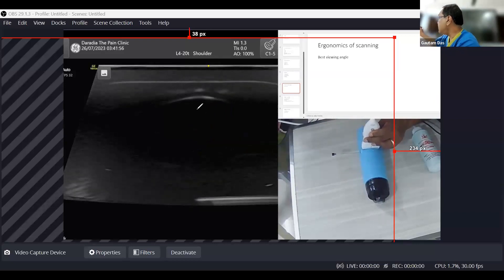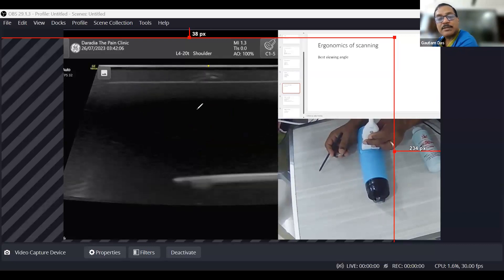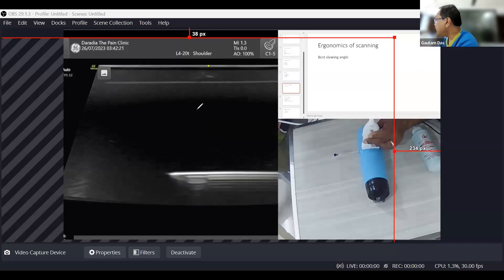Here my needle is very nicely seen because it is almost horizontal. To decrease the angle, take the needle entry point further away from the probe; then you can reach the target keeping the needle almost horizontal. You can also see the reverberation artifact here.